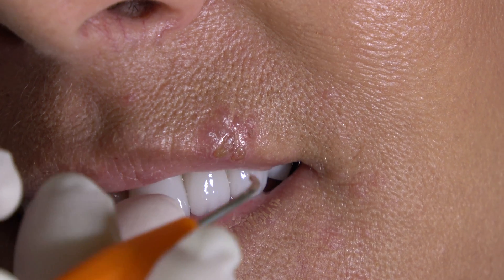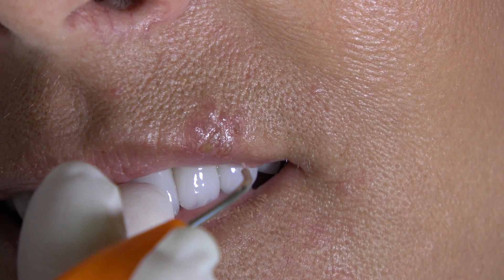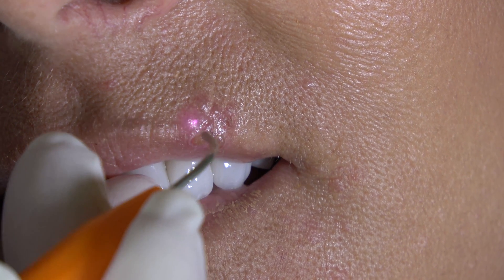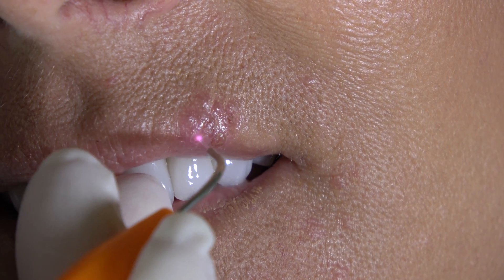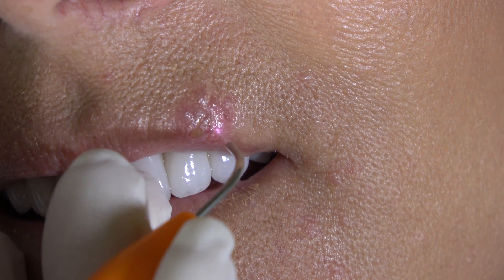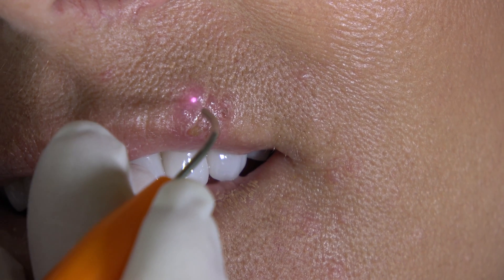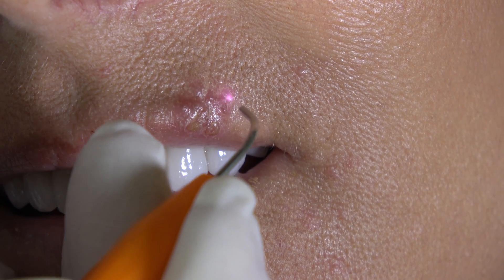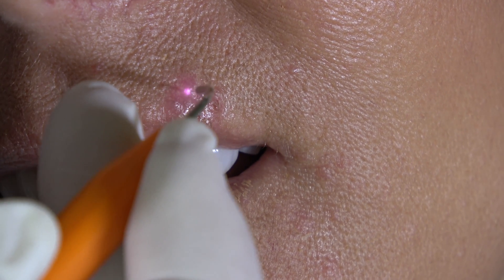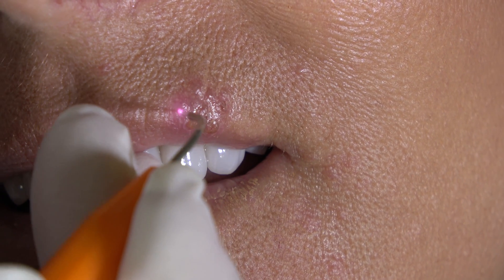Our goal is — I typically start about 10 millimeters away. Do you feel that much? You're going to feel heat. Going back and forth, getting as close as I can without it being too uncomfortable for her. I do not use anesthetic because I want her to give me the feedback of when she feels it.